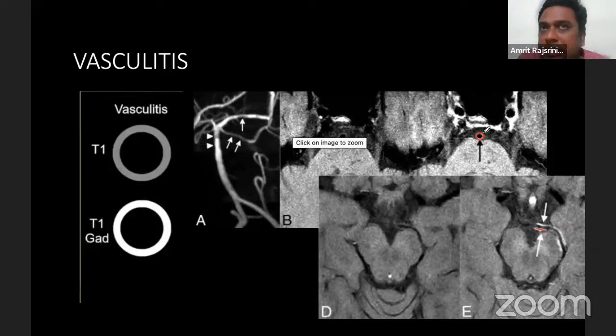Yeah, usually it is concentric. Yes, in nearly 2/3 of patients you would get it as concentric thickening and enhancement. And you've not discussed the grade of enhancement. You always compare it with the pituitary stalk. The pituitary stalk enhances in post-gadolinium T1 imaging. So if it enhances nearly up to the pituitary stalk, because in vasculitis you get very avid enhancement, it's grade 2 enhancement.